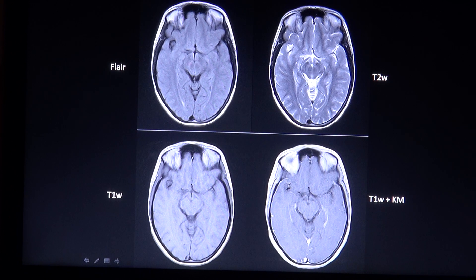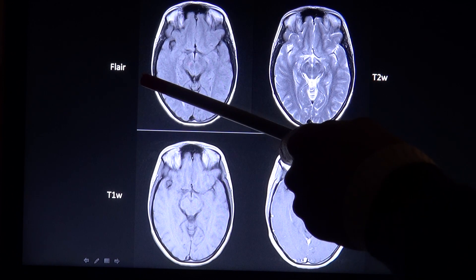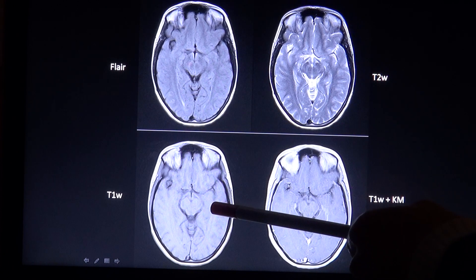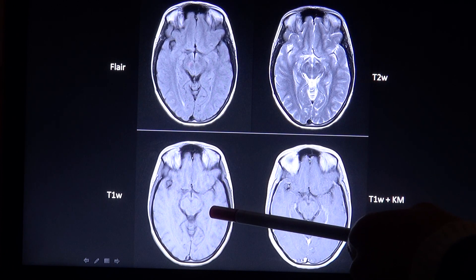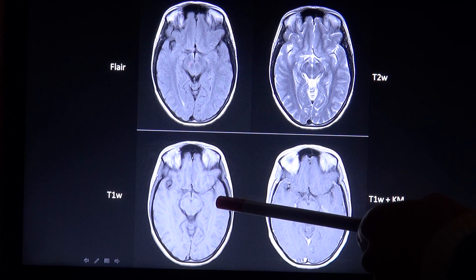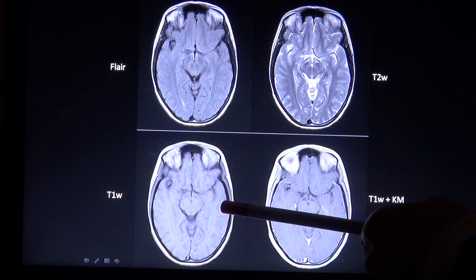So, superficially, a FLAIR sequence resembles a T1-weighted image because water is dark, but unlike on a T1 image, a pathologic lesion appears bright.